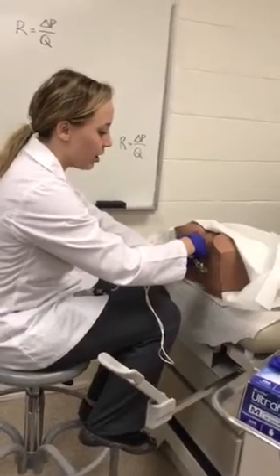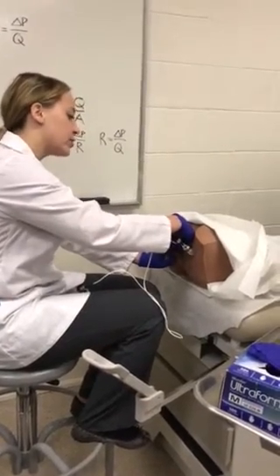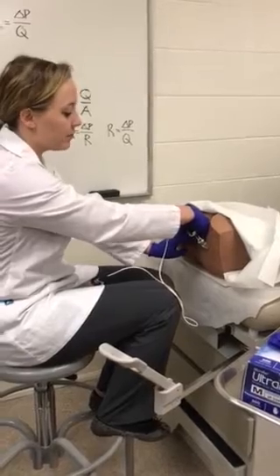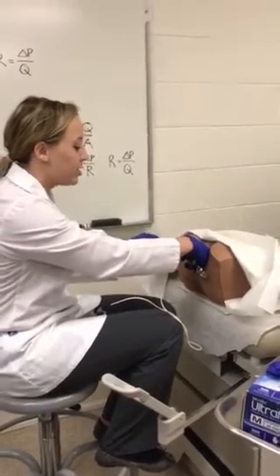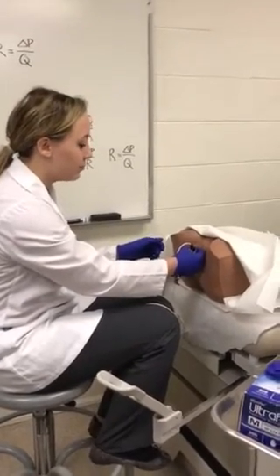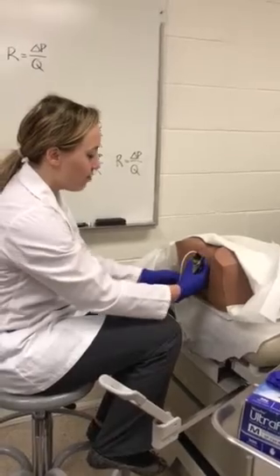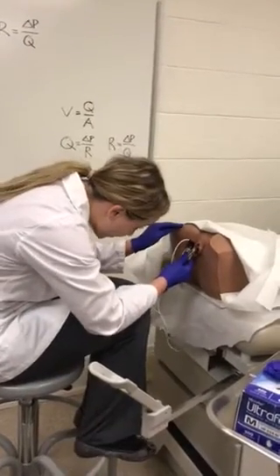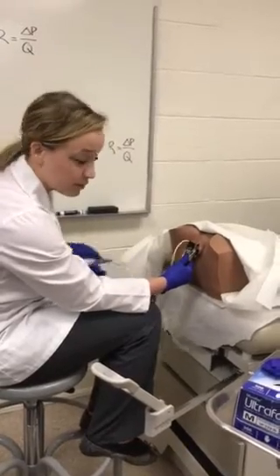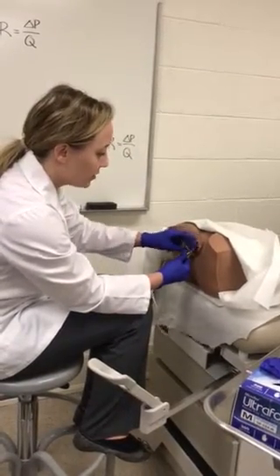I'm also going to use my hand to split the labia to make insertion a little easier. As I'm inserting the speculum, I'm keeping a posterior and downward slope to keep the introitus relaxed. Once the speculum is all the way in, I'll release my finger on the introitus but maintain downward pressure. I'll move it into a horizontal plane keeping posterior pressure, ensure it's fully inserted, then open it up and make sure the cervix is cupped in the speculum. I'll confirm my light source is on, adjust if needed, then lock in the speculum — but not prematurely.